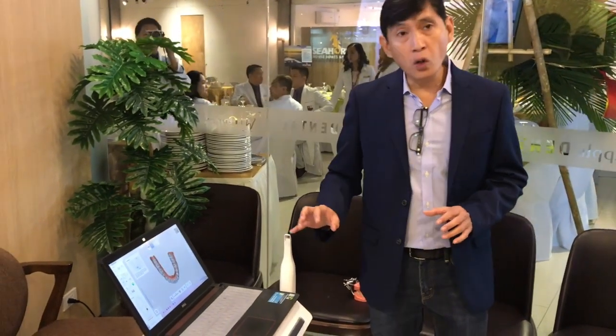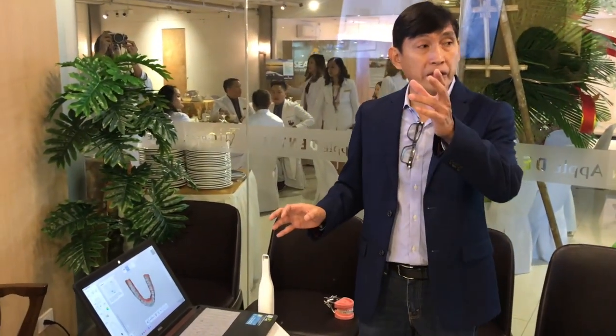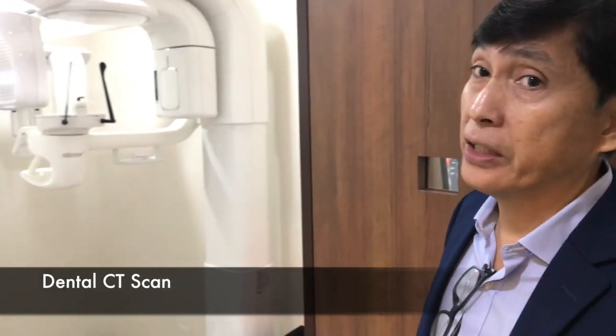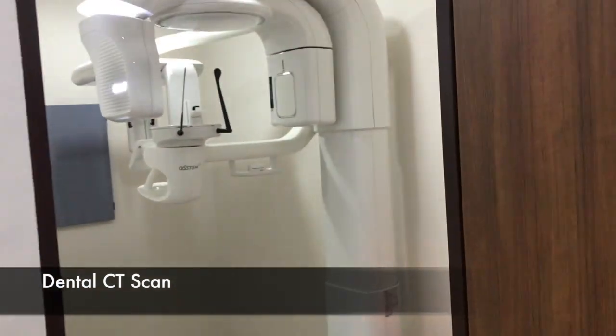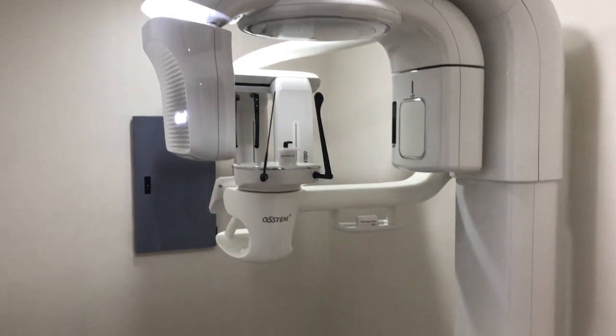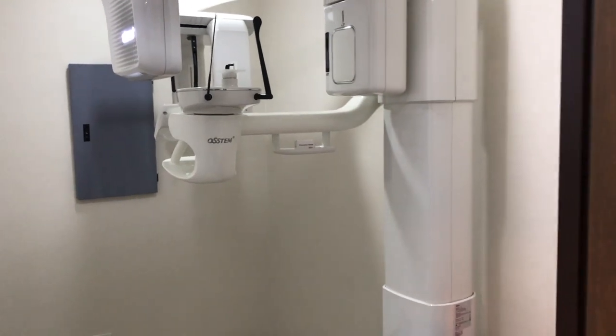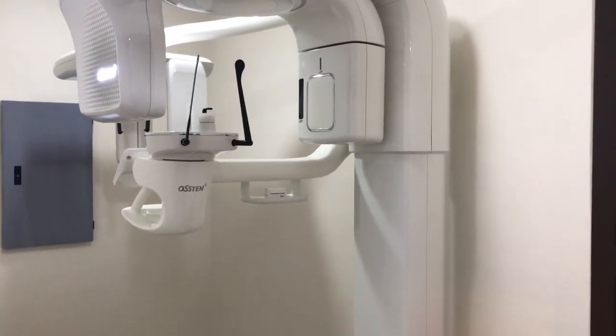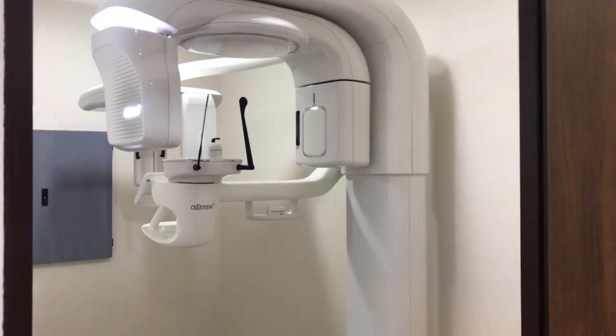Also, this one combined with our CT scan, we can do what we call implant planning, for placing dental implants. I'll show you what's called a CBCT. This is basically the dental CT scan. So instead of the usual 2D X-ray picture, we have a 3D image. We use this to diagnose, like if you have lesions in the mouth or fractures.